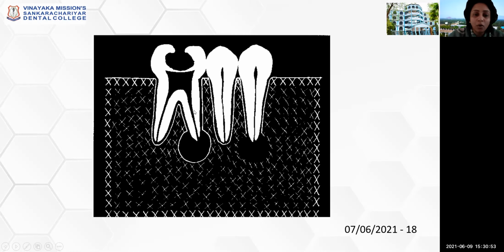The points to be taken into consideration are the radiolucency size, the vitality of the tooth, the expansion pattern of the radiolucency, whether the border is well defined or ill defined, the corticated margin, and the location of the radiolucency on the radiograph. All these features will help us avoid misdiagnosis and diagnose the lesion at the earliest, so that we can properly manage the condition.